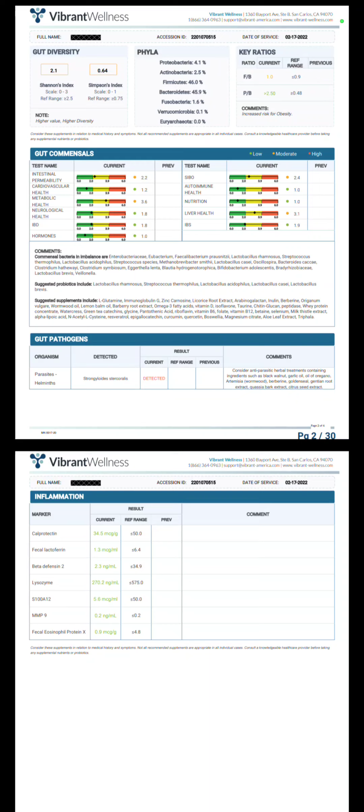Underneath the phyla, you'll see different families here. This person's looking pretty good, but with other people, if their proteobacteria is incredibly high, that's something for us to be of concern, and that can drive things like E. coli or other gram-negative bacteria. And so it's just a way for us to see, out of the diversity that there is in the microbiome, what is it that is the most rich?